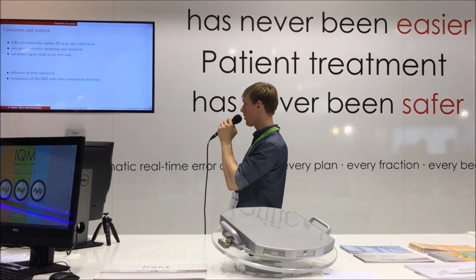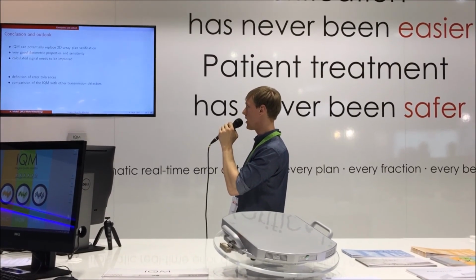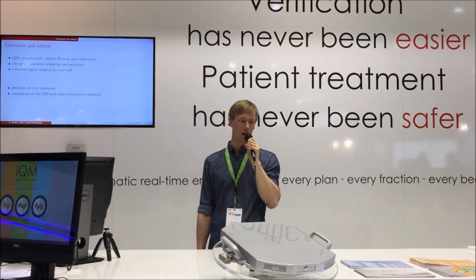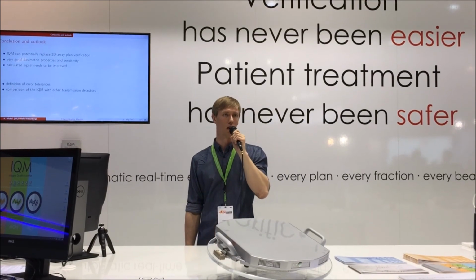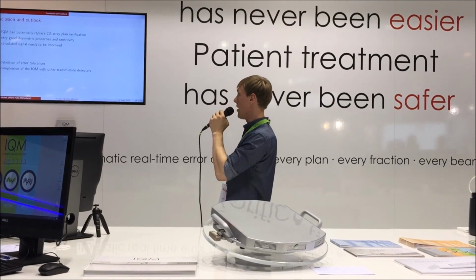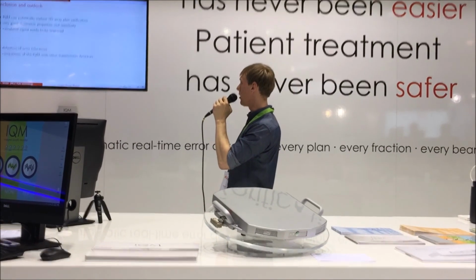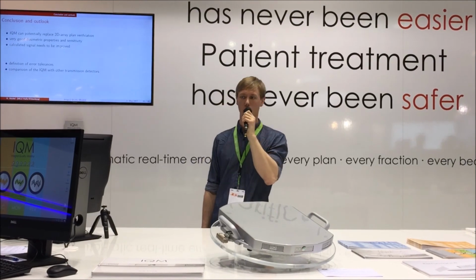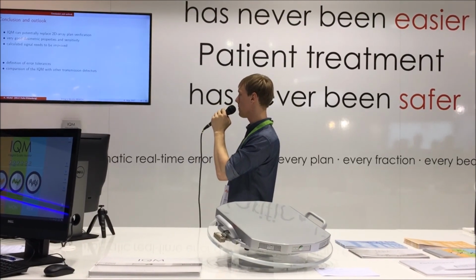To give you a brief outlook on our upcoming investigations, we actually defined the error tolerances already and are testing them out with lots of pre-treatment QA. And for my master thesis, I'm actually comparing the IQM with other performances of other treatment transmission detectors.